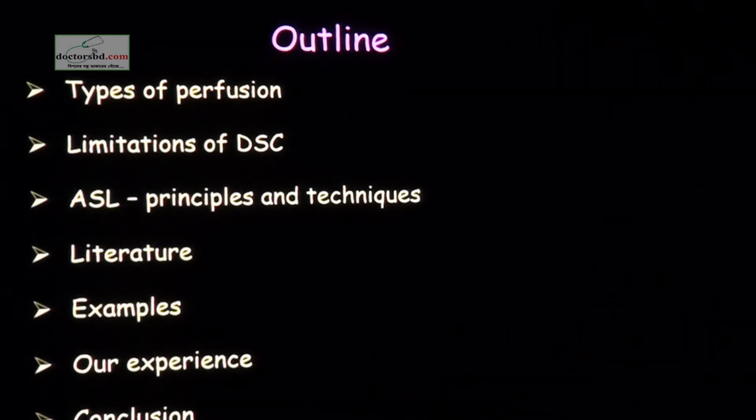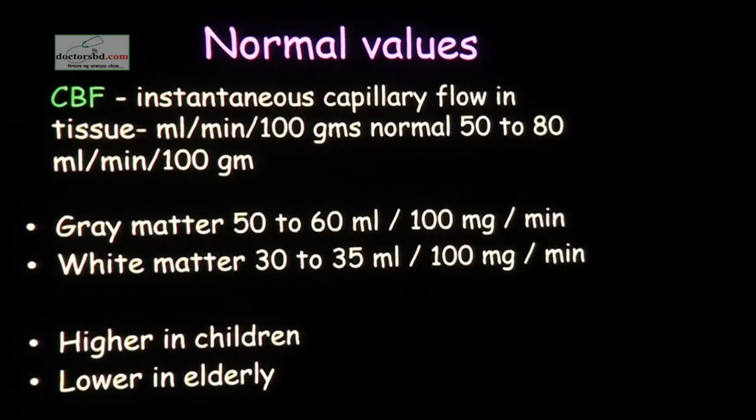And we will look at principles of ASL. How did ASL come into the picture? We look at some literature, some examples, and our experience, and maybe encourage you all to use it in practice, as you all have the newer magnets and the newer software.